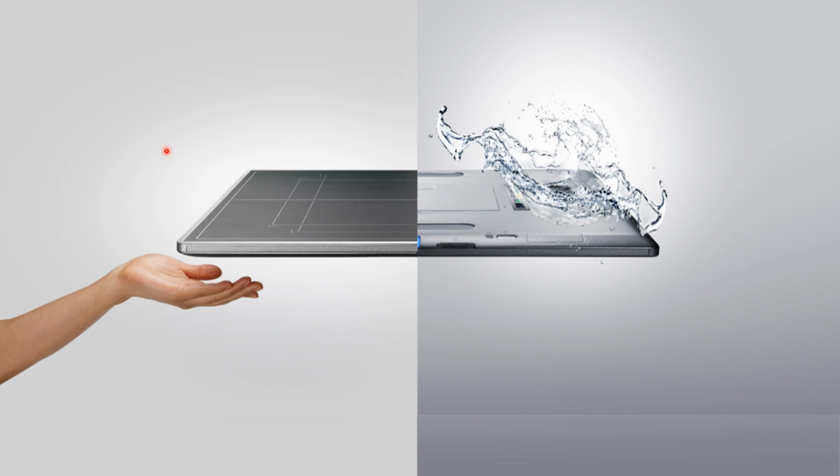These are your retrofit, or can fit in a normal DR room, X-ray detectors that are fitted with carbon fiber. They've got a battery and are completely wireless. When they're ready to accept radiation, you have to prime them. You fire it and it takes an image, and boom, literally three seconds later, your image is on your screen. And these are absolutely fantastic. They have great detail. They have even detail across the plate. You used to have to X-ray certain body parts in the center of the old X-ray cassettes. These are absolutely superb, and this is a credit to Fuji on that.